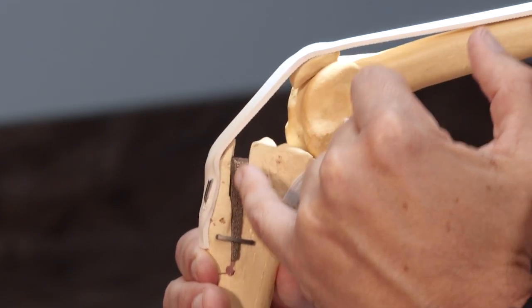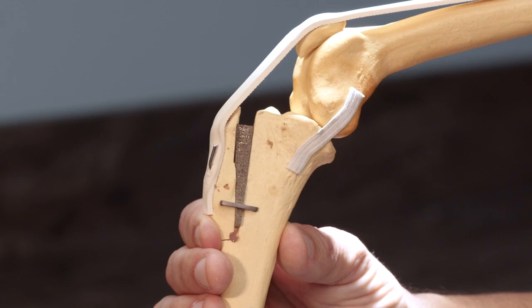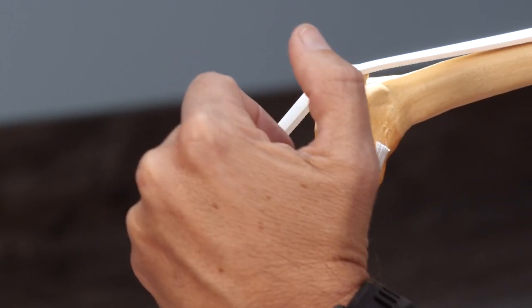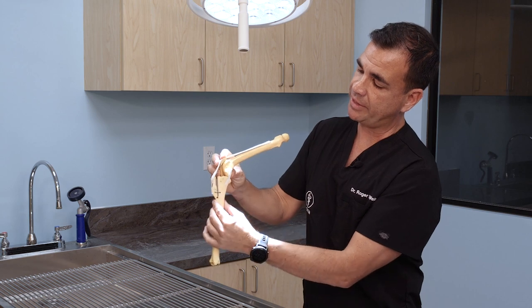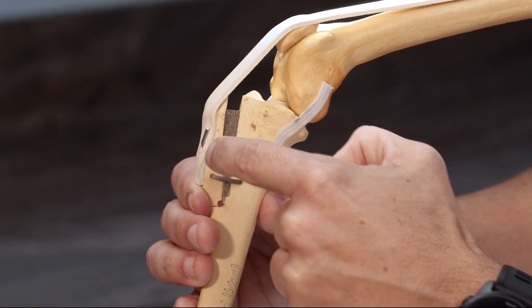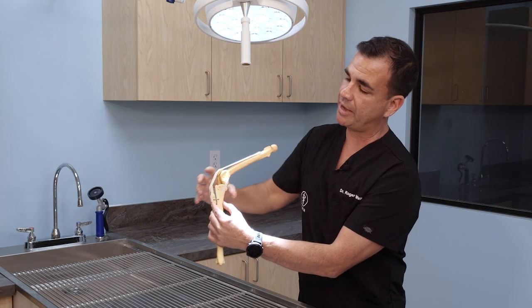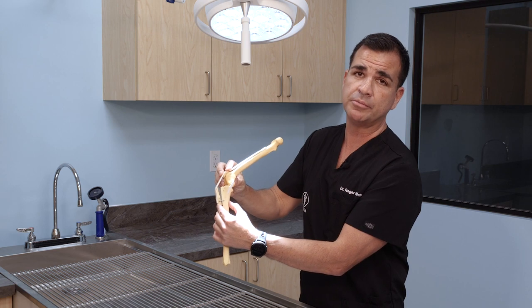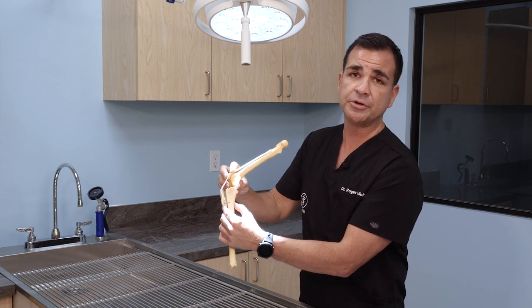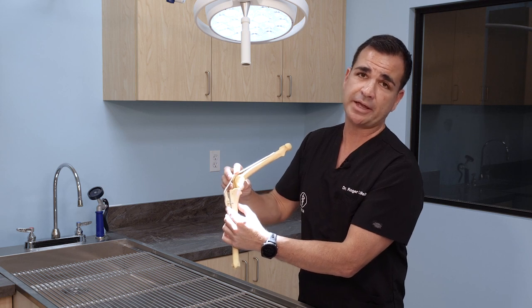We insert a spacer here — a titanium wedge called ortho foam — and we compress that with a pin from front to back. We bend the pin tip north like that. We place two small holes here and pop that staple in to stabilize the distal osteotomy site, and what we're left with is a nice stable knee that is no longer moving. This is the latest and greatest in cranial cruciate ligament repair, and the recovery time is six weeks or less.